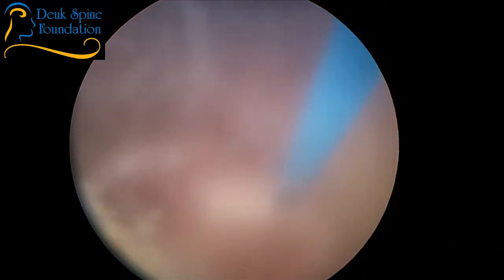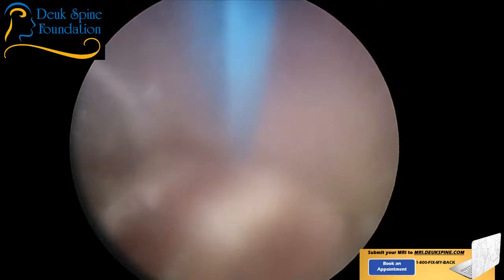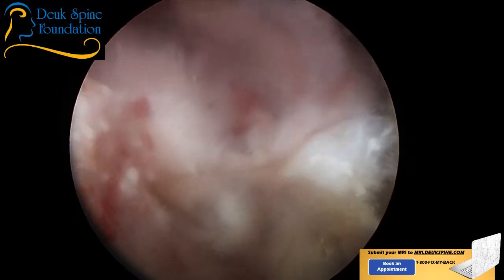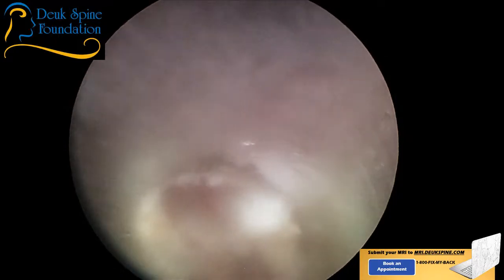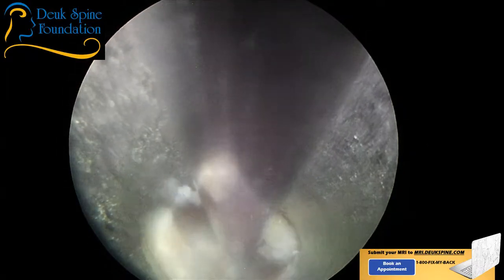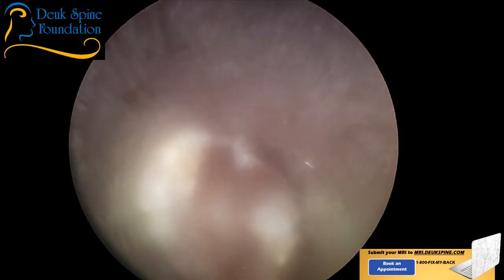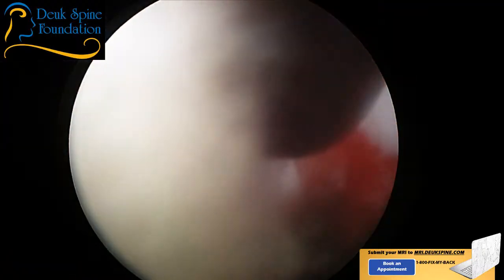And so when you start stimulating the patient with pain going into the disc, they're going to start worming around on the table, wiggling and worming. And that causes their axial musculature to tighten up. And that axial musculature is what compresses the bones together in your vertebrae, your spine. It pulls your bones down on top of each other. It basically collapses the disc space. And that is actually what causes the jelly to squeeze out of the disc space in the first place. When you have an annular tear, to get a herniation, you need the jelly squeezing out.